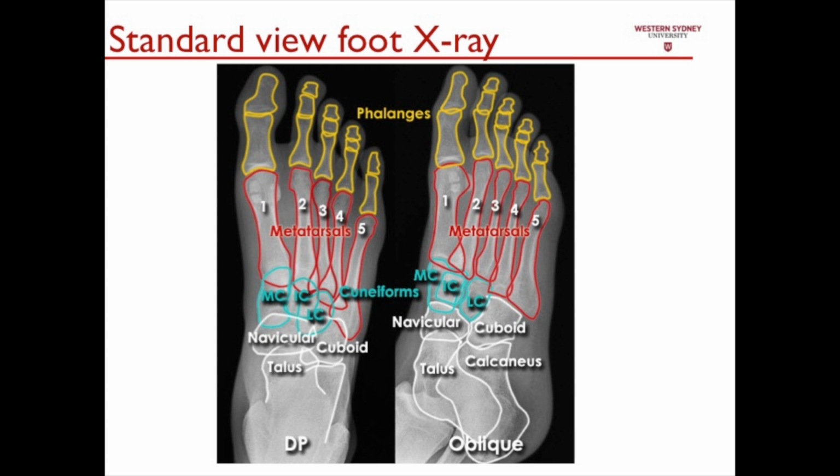However, what you will note is that for your convenience, the outline of the respective bones have been outlined. It's important that you begin to get the appreciation of how bones will appear superimposed over the top of others, as we have a 3D representation compacted to become a 2D image.